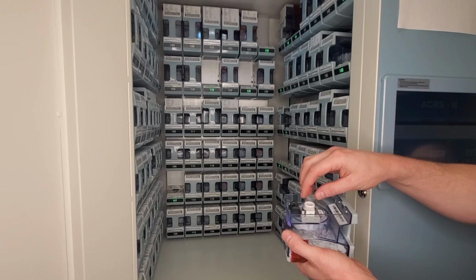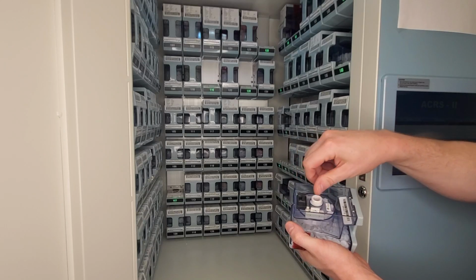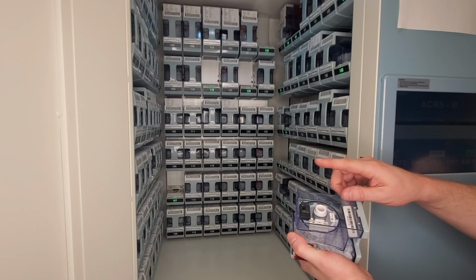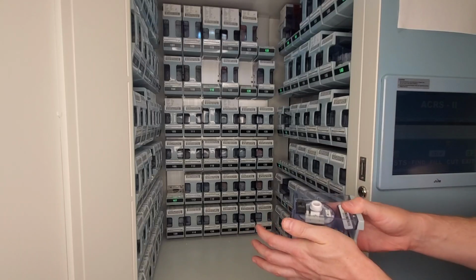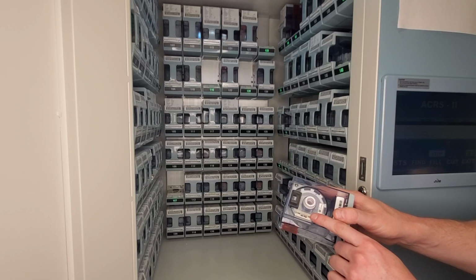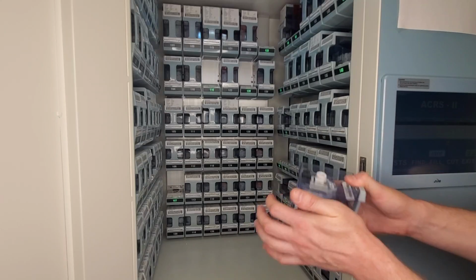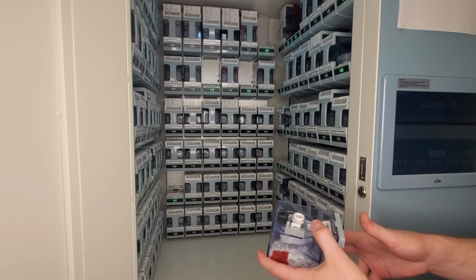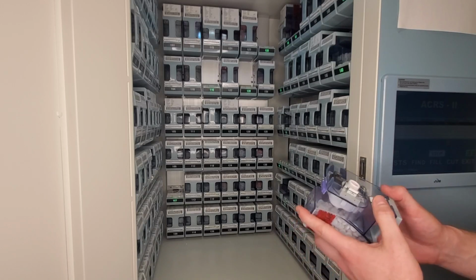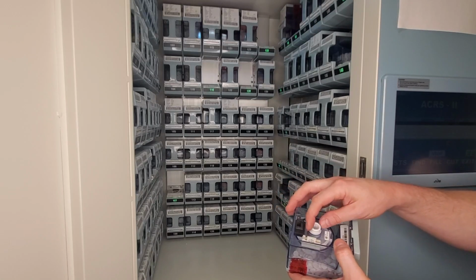And I need to make sure that this white piece, known as the crown, can spin freely in each direction like this. If it cannot, I need to gently shake the canister, being very careful to not hit the microchip portion of the canister. I can shake it, I can hit it. The only thing I don't want to do is hit it up against the machine, the wall, or the floor, because the canister will break. Once I shake it and unjam it, it should spin freely like this.